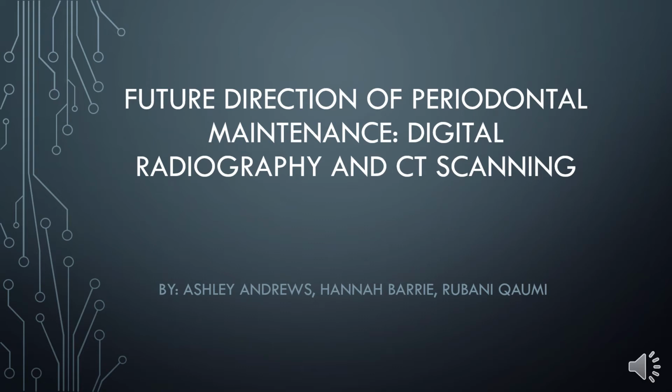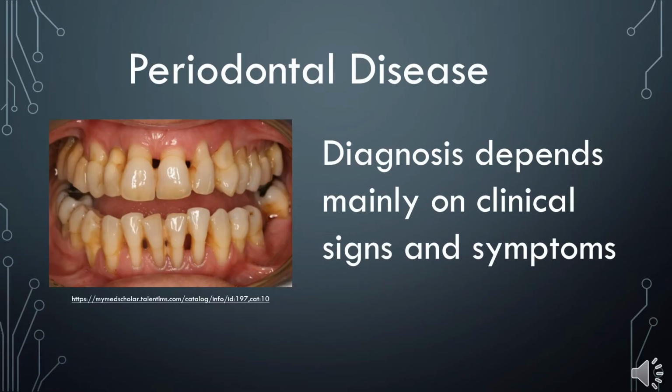Hello, fellow dental professionals. We are here to talk about the future direction of periodontal maintenance relating to digital radiography and CT scanning. Periodontal disease is the inflammation of the hard and soft tissues that results in attachment loss and destruction of bone. Diagnosis depends on clinical signs and symptoms. However, radiographs are an additional valuable tool.